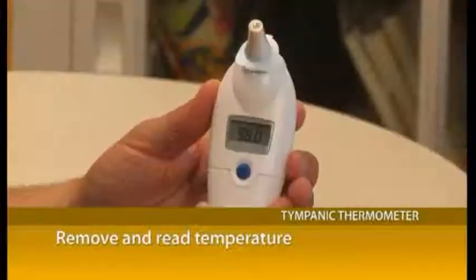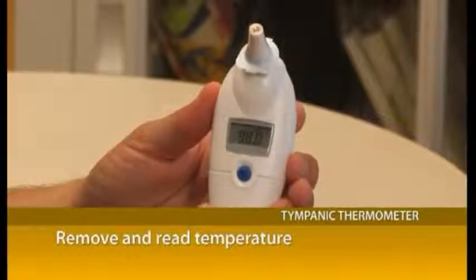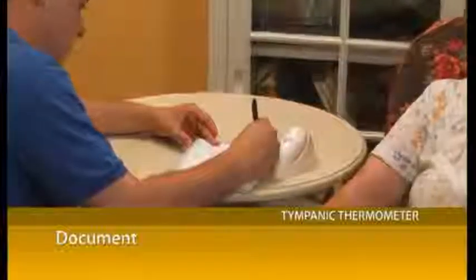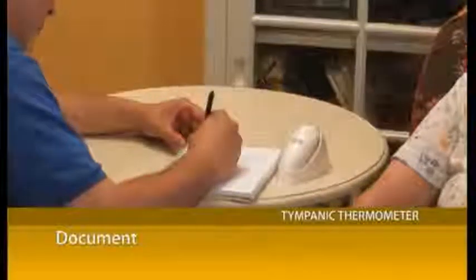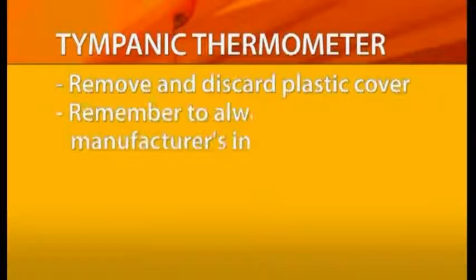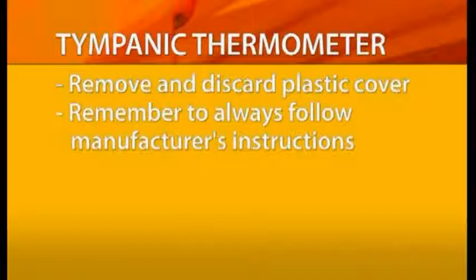Remove the thermometer from the ear opening. Document the temperature reading. Remove and discard the throwaway cover. Again, a reminder, always follow the manufacturer's specific instructions for the device you will be using.